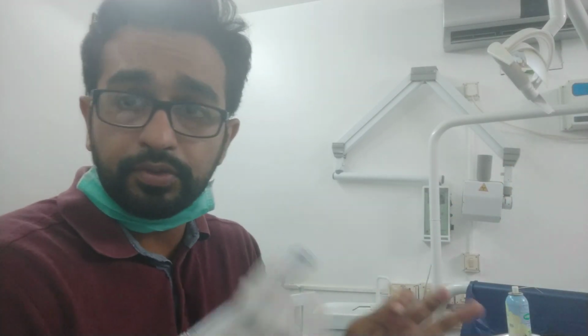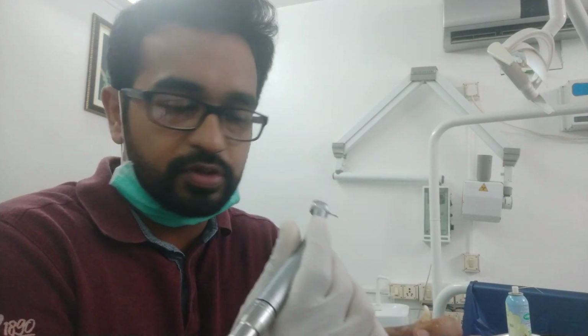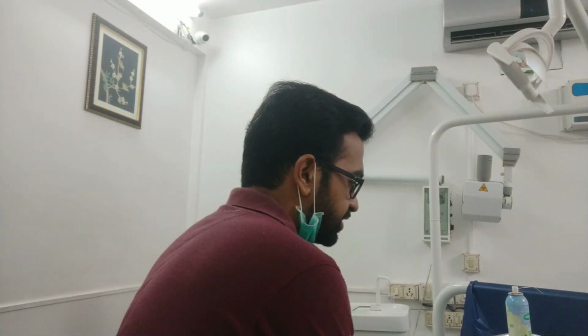So when you do this, when you are working on the tooth, you will get a small release of pressure. It means when you are making the hole, you are giving some force, and at a particular point suddenly your hand will move. It means you will feel like there is no tooth at all. That is the canal or the pulp chamber you have entered. So as soon as you enter, you make a ditch hole.